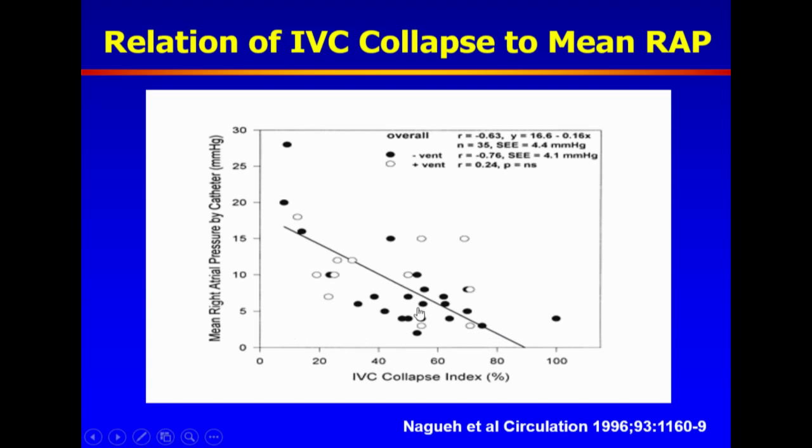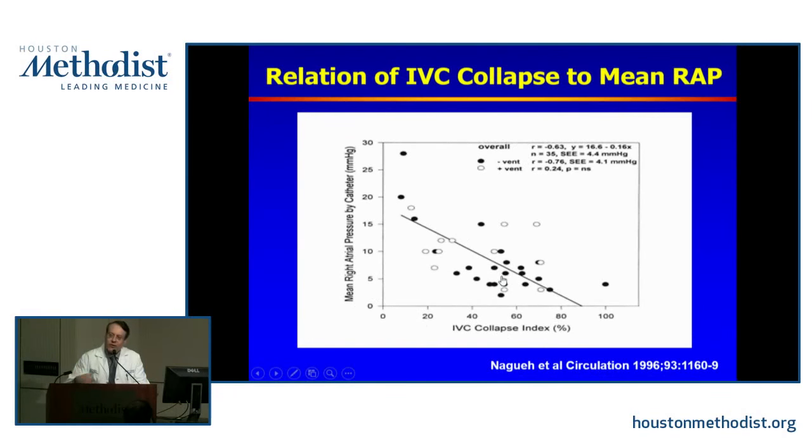In these patients, the main value of the IVC is if it is not dilated. If it is not dilated and, say, spontaneously collapsing, you're sure RAP is normal. But if it is dilated, they are not automatically with increased RAP. One thing that we've asked for is if you are scanning a patient in the ICU and they have an RA pressure catheter, it's a good idea. You can include that as part of the report, and then whoever is reading can add that value without having to estimate. The guidelines actually say that is okay.